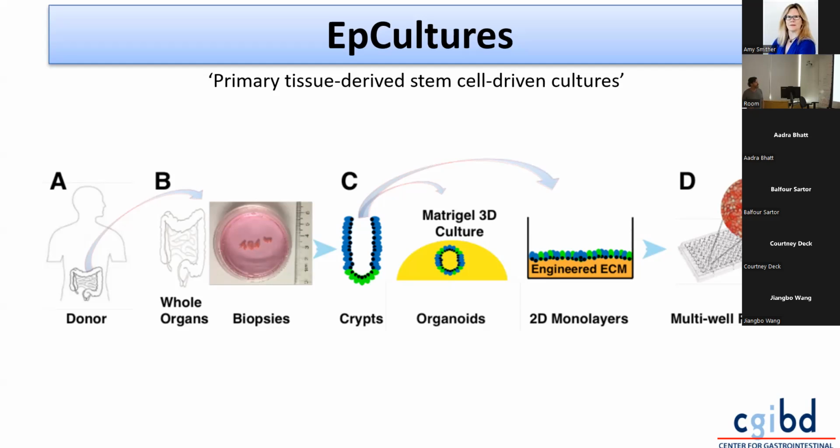And then we apply these stem cells to either a three-dimensional culture system, which is a hydrogel dome, typically between 15 and 25 microliters. It's a droplet of extracellular matrix that solidifies or polymerizes, and it stays in that dome shape, and the stem cells are encapsulated in that. They will continue to proliferate and grow into these three-dimensional spheres given the media conditions that we supply to them. And they'll keep growing indefinitely as long as you feed them and you split them and things like that.